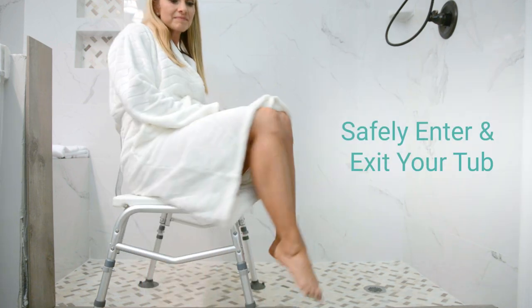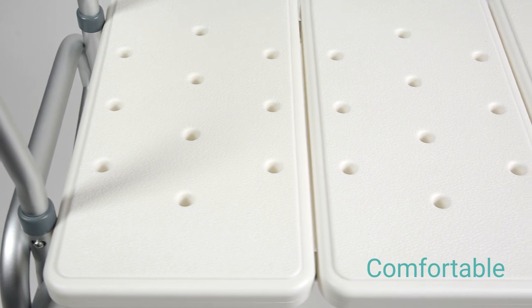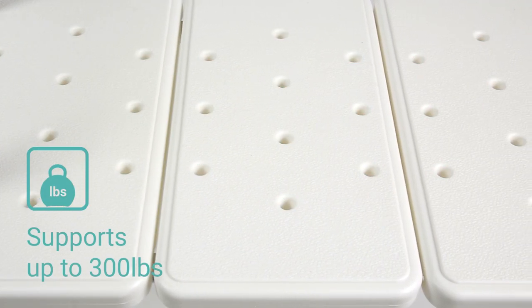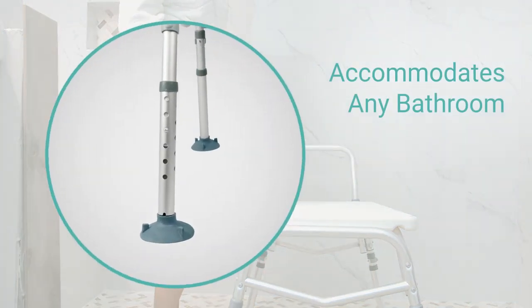The Tub Transfer Bench by Vive allows you to safely enter and exit the bathtub. A comfortable molded seat supports up to 300 pounds and features drainage holes to prevent puddling. The reversible arm and backrest accommodate any bathroom, and the legs adjust for personal comfort.